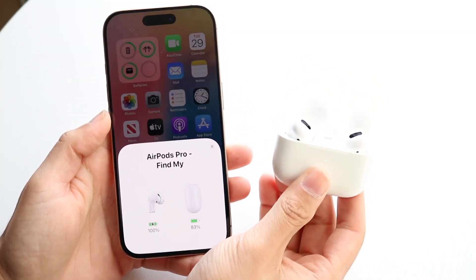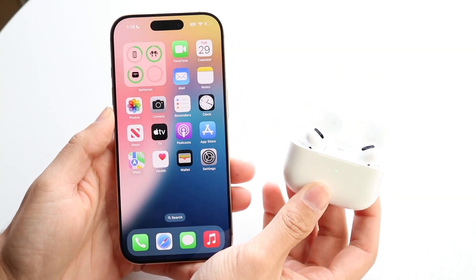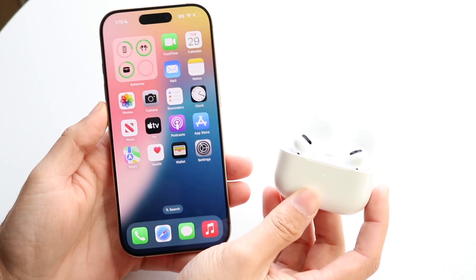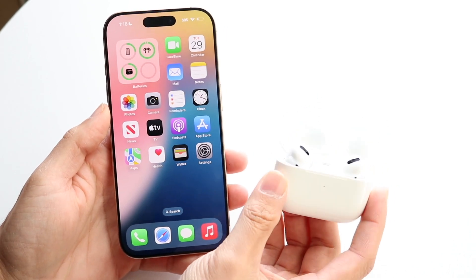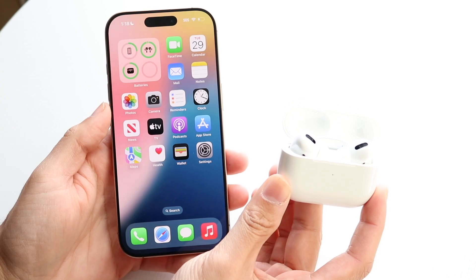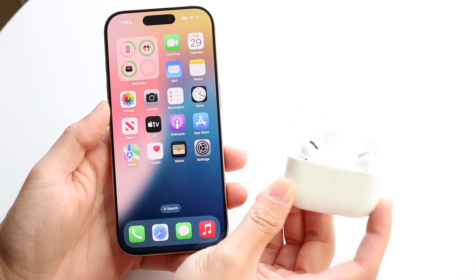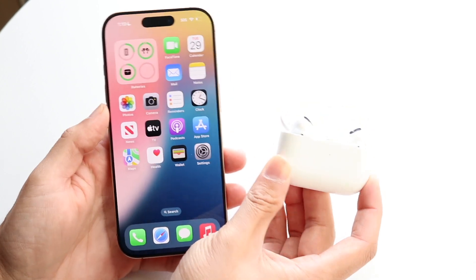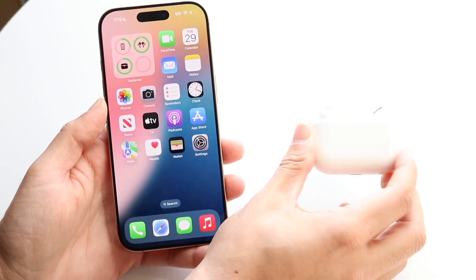You might be somebody who's trying to use your AirPods as hearing aids. Luckily, this is a very basic process, but you will have to do one thing: make sure that you have AirPods Pro second generation. If you have the first gen or any other AirPods, that's not going to work. You have to make sure you have AirPods Pro 2s or above.